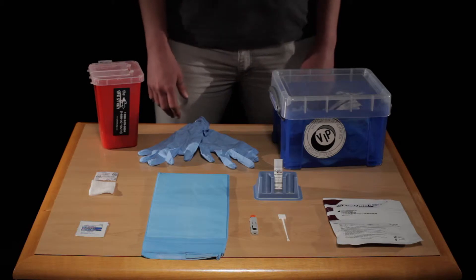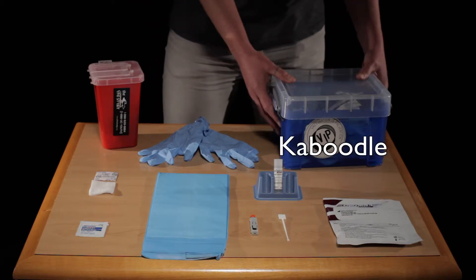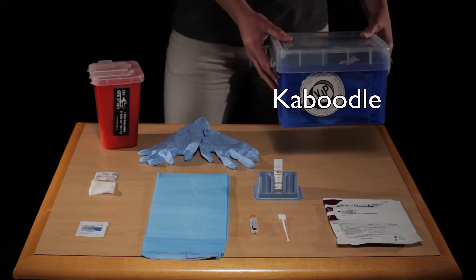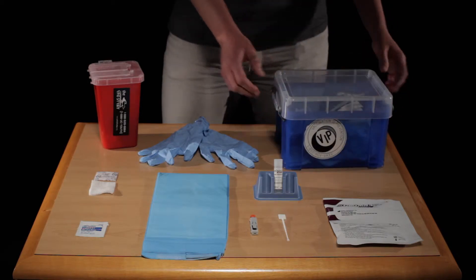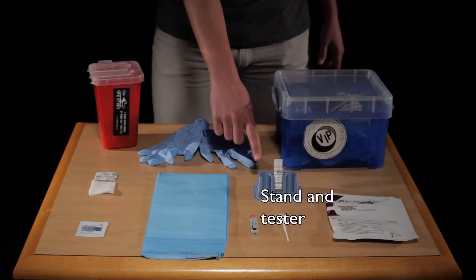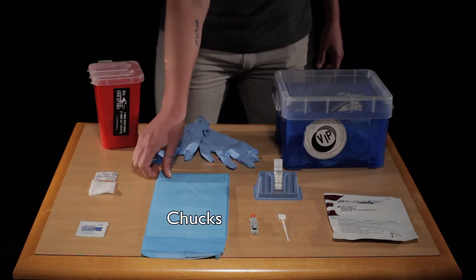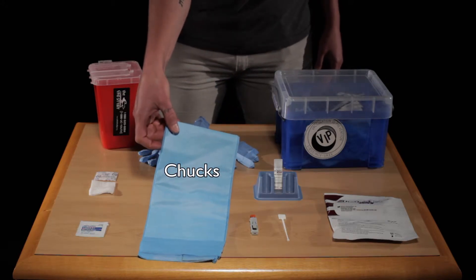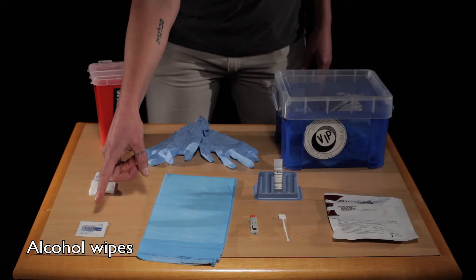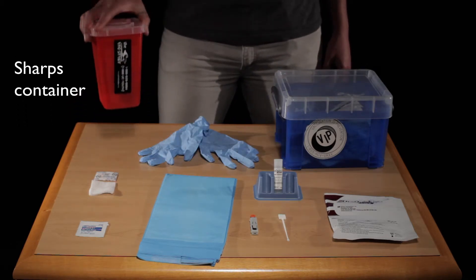At UFO, we put together little kits with everything we need for a test. We call them caboodles. These include the Orasure Fingerprick Test Kit, wand for blood, stand for tester, and the tester, lancets to poke the finger, chucks — which are pads that we pre-cut into small squares and put them under the participant's hand — alcohol wipes, gauze, band-aids, gloves, and of course a sharps container.